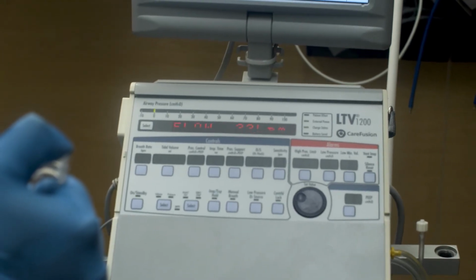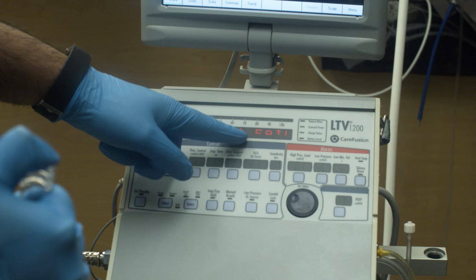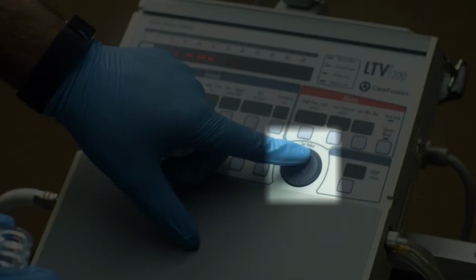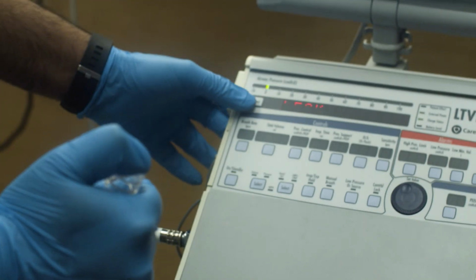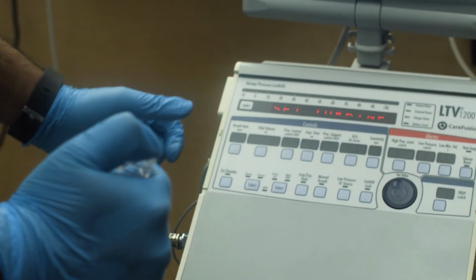You'll notice that we've simulated a faulty circuit by unplugging one of the tubes from earlier. Our demo test has failed, and these faulty connections are the usual cause. Make sure everything is plugged in tightly and navigate the menu using the dial on the bottom right of the panel until you see the screen say leak again. Occlude the open end of the main tubing one more time and press select.